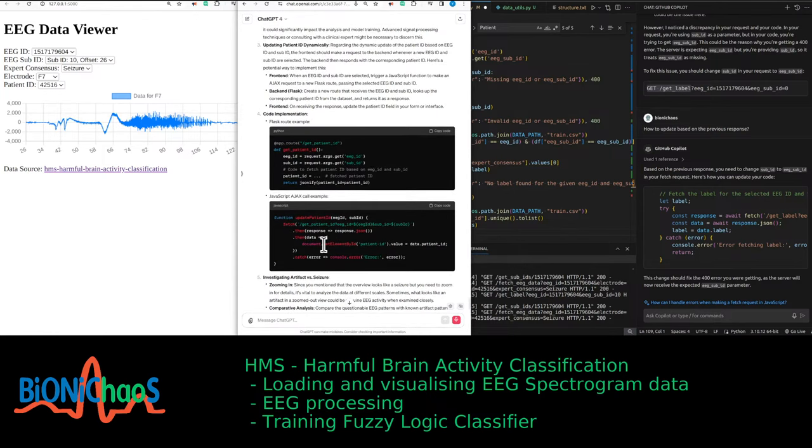You've made some astute observations about your EEG dataset. Let's address them. 1. Similar patterns in EEG and ECG. The similarity you're observing between EEG and ECG patterns is intriguing. Usually, EEG, brain activity, and ECG, heart activity, should exhibit distinctly different patterns. The similarity could indeed suggest an artifact or some form of interference in the EEG data.